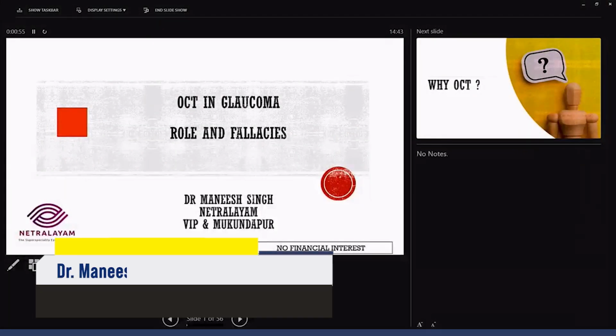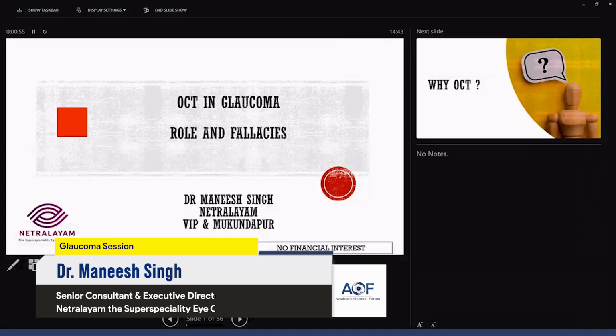Thank you, Arijit. It's really an honor to share this platform with such dignitaries and especially Ramanjit madam. So I'll be speaking on the role of OCT and what are the fallacies we have. So why is OCT so important for glaucoma practice?